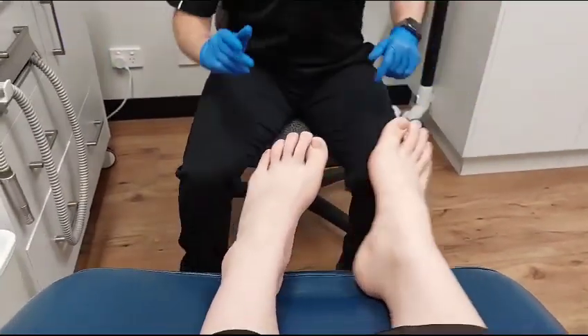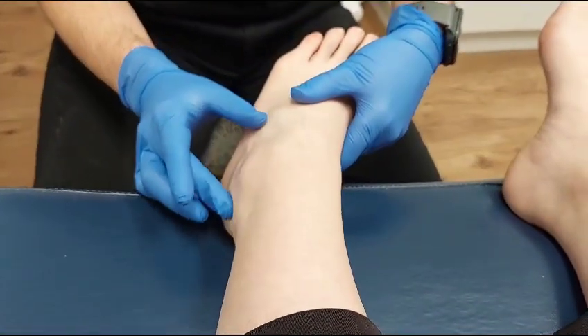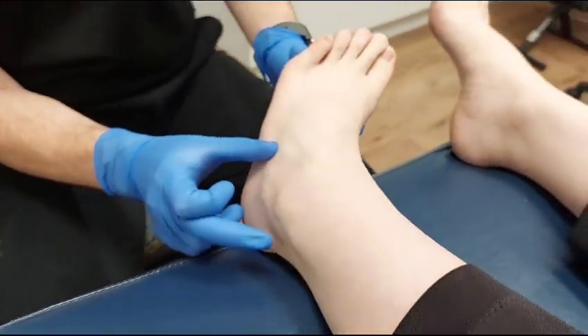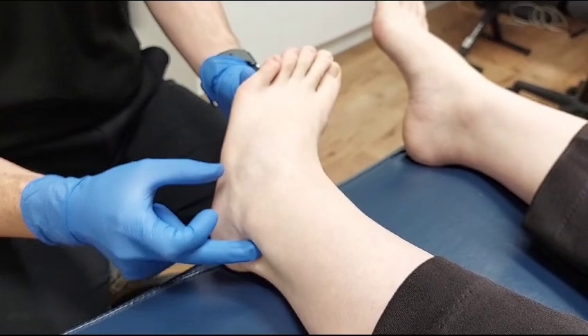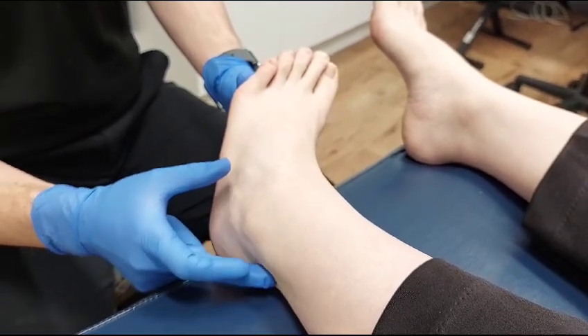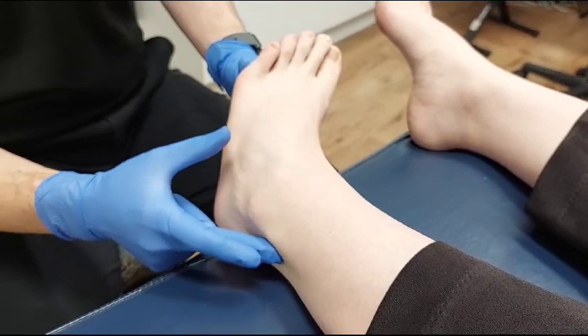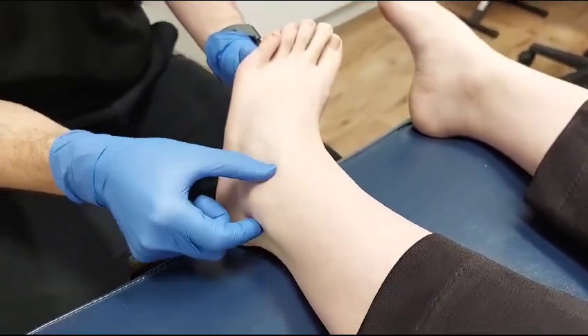We are going to do a sural nerve block just over here. Finding the lateral malleolus, you can see the peroneal tendon there, so we know the nerve is just hiding under that. We've got actually quite a nice sulcus sitting over here — my model seems to have very nice round malleoli.